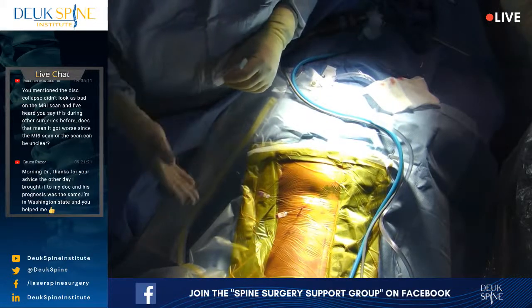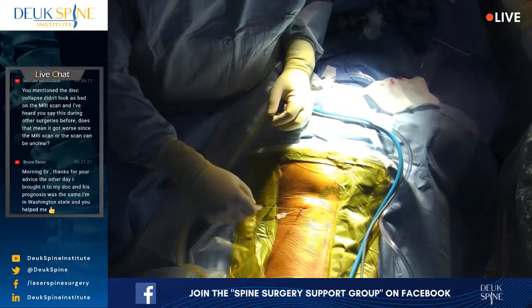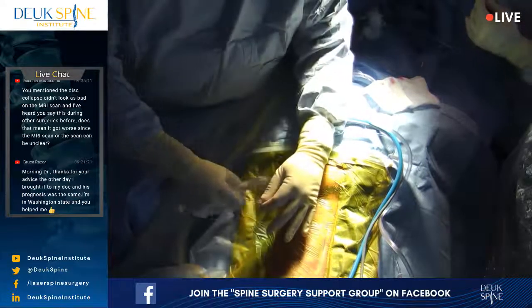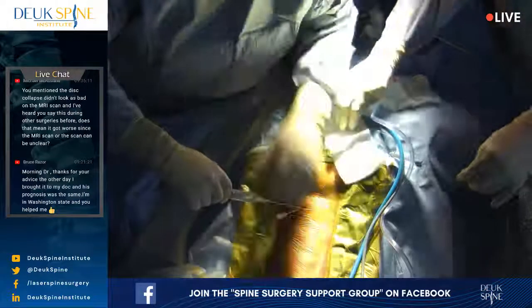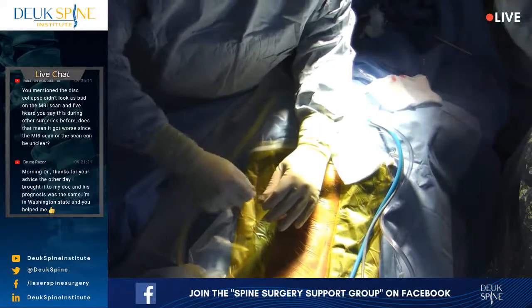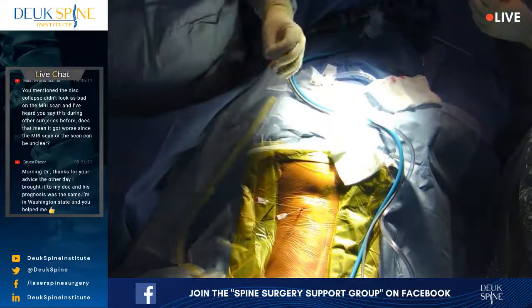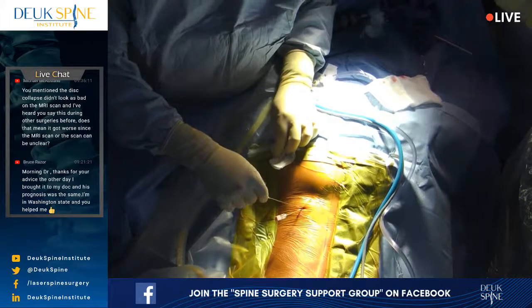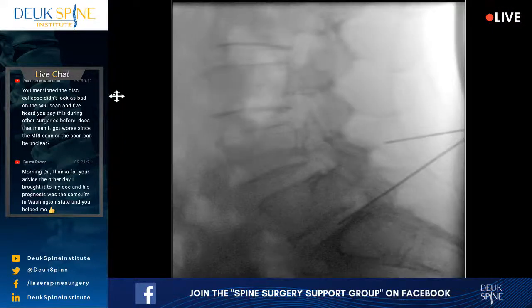And what I have to do here at the beginning is account for those geometrical anomalies that do occur with different people, on top of everything else I'm doing. And that's why I have to line the fluoro up so perfectly as much as I can, because yeah, that's just numbing medicine going in. It's trying to make you feel better. If you don't line it up properly, you're going to end up putting this somewhere it doesn't belong, and then you get a complication, and that's not a good thing. So we've done this surgery now for, just relax, Sean, we've done this surgery now for 15 years. I've never had a complication.